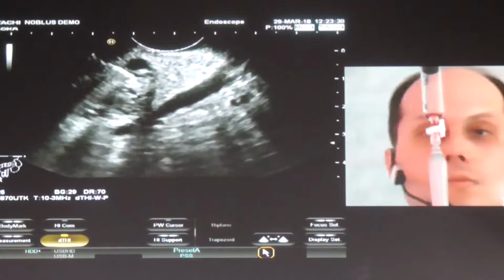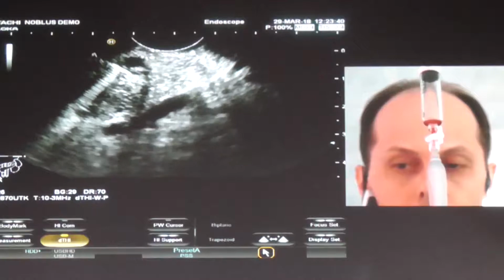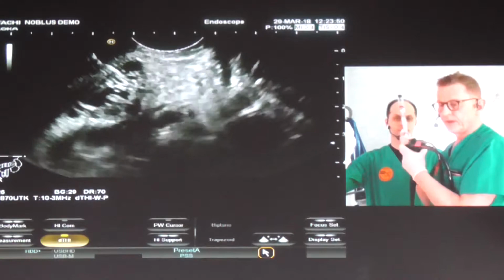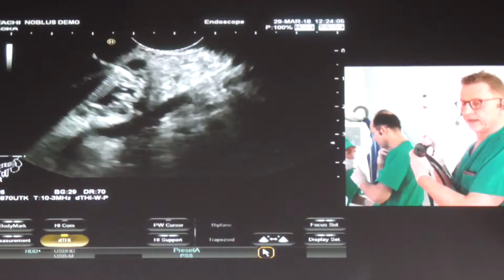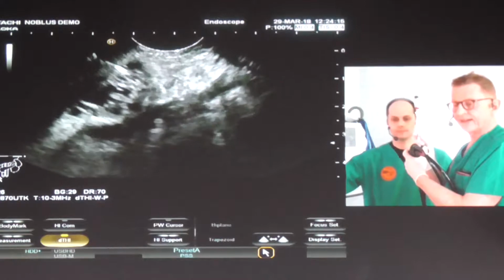Presented for cytology, yeah. It's Jerry speaking. For the audience, which are the risks related to FNA within this system of practice? Because the risks should be balanced against the benefits of the diagnosis. I quite agree with you. You should always think about the risk for the patient. And there are two risks this time. Of course, bleeding is always a risk. It's very rare that there is a significant bleed. The other thing is pancreatitis. This is also something that you have to consider. And secondly, infection of the cyst.